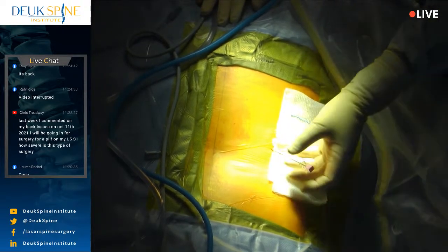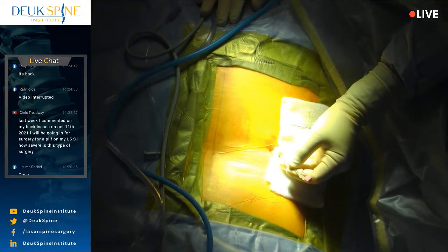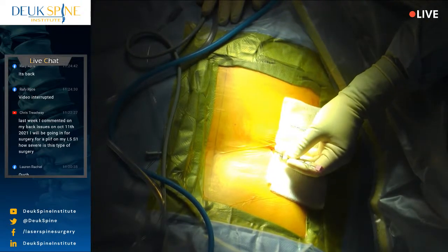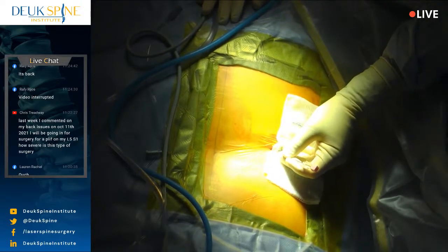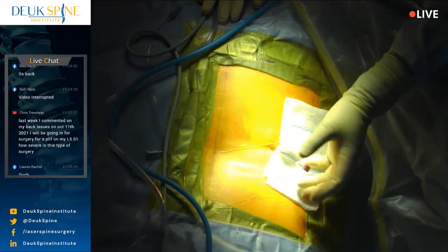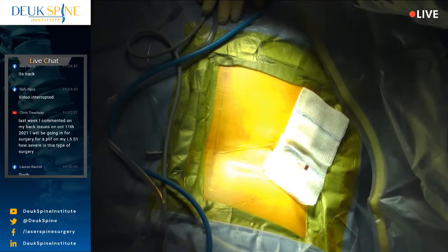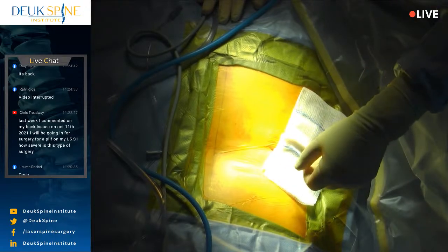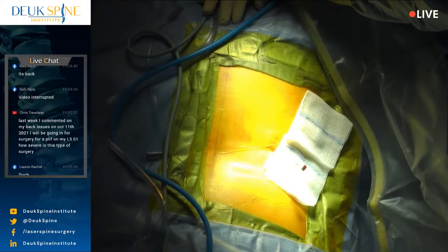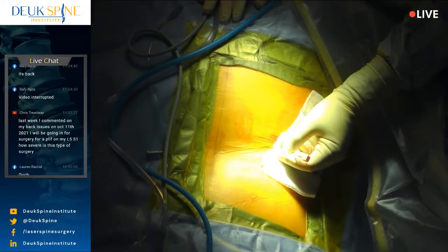So we're not just navigating to the spine, we're navigating to a very specific place. And it's literally a place that's a millimeter target. And that is the tear in the back of her disc, right where the herniation is. So I need to use information like the fluoroscope to navigate there. And I also need to use information like the patient telling me. I need the patient to say, oh yeah, that hurts. I feel pain in my back. I feel pain in my leg. Where do you feel pain? Don't move.